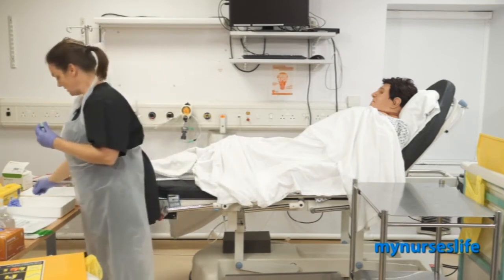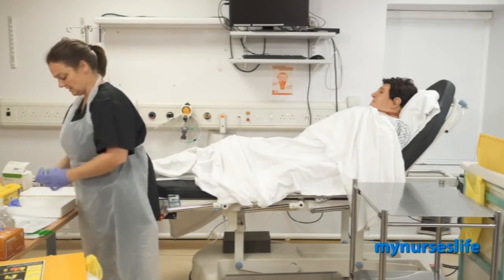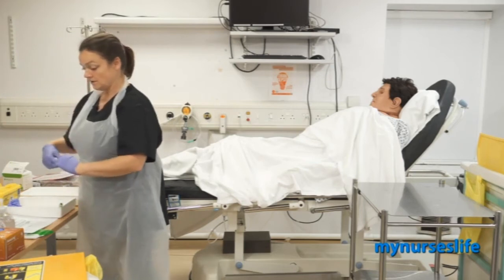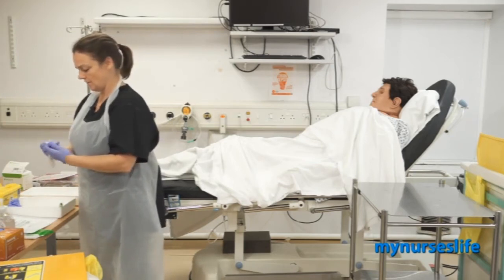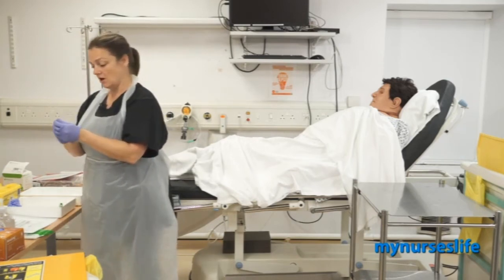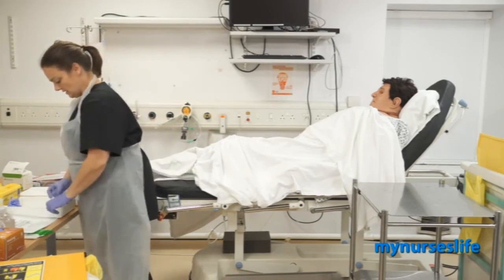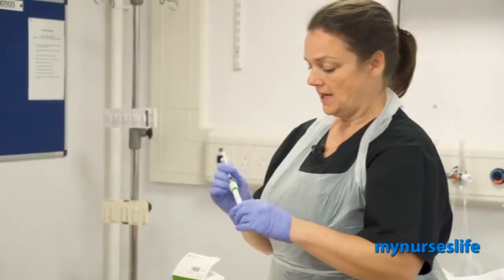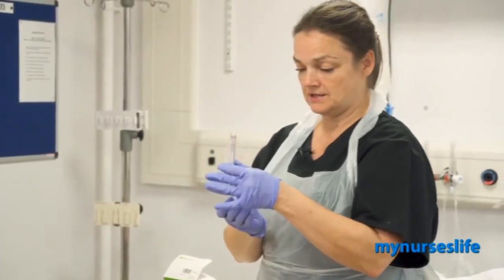And I'm going to leave that, do it for 30 seconds and let it dry for 30 seconds. I'll assume 30 seconds is gone. I'm going to take the lid off and keep it in the tray. And take 17 units.